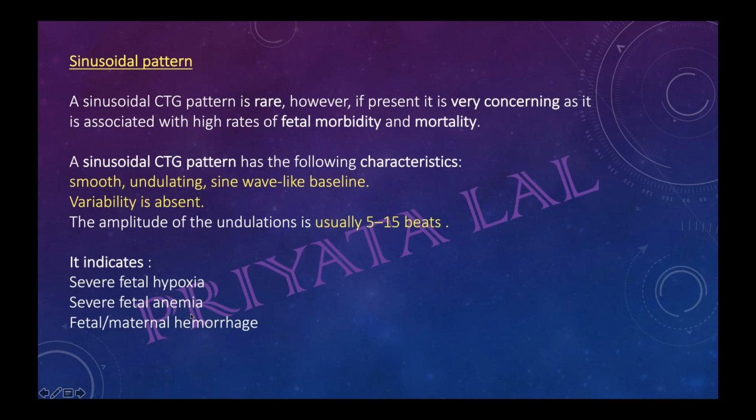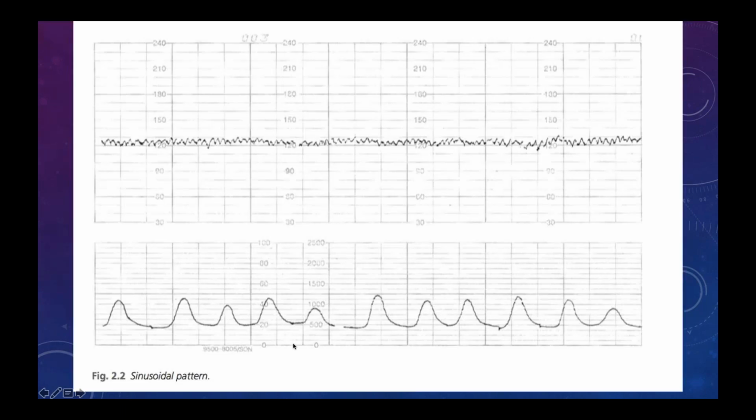Yes, it is parvo. What does parvovirus do? Usually parvovirus affects newly developing RBCs, so RBCs are not developing inside the fetus. So the baby will have severe anemia. Therefore, they show signs of hydrops, and the treatment is intrauterine transfusion. So all this explains severe fetal anemia. So now you will never make this mistake. If this kind of CTG is there, it is nothing but parvo.